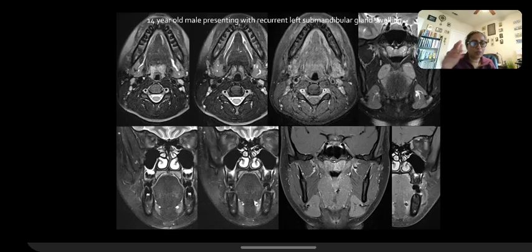Or if you're monitoring the study, most of the times when I'm monitoring a study and I see it, I'll ask the technologist to add that to the protocol, and then they'll do it. So obviously CT is better to see it, but sometimes the patient is getting an MR and you can still see it. You can recommend a CT, because you can have multiple stones, and you may not be able to see small stones on MR. It's better seen on CT.